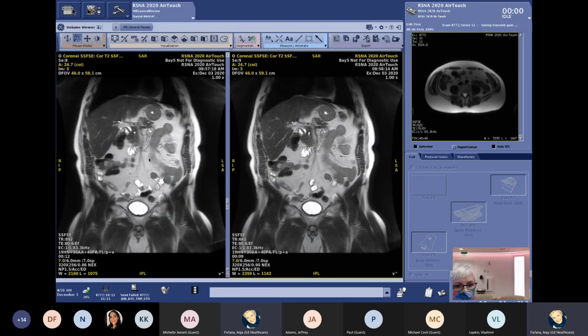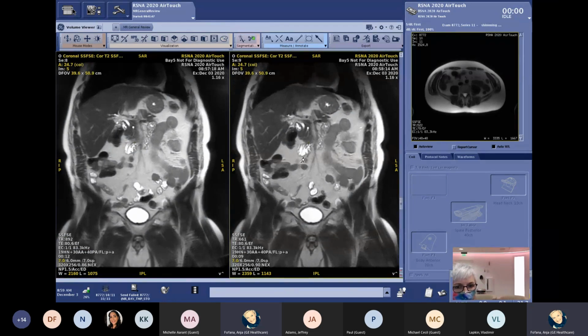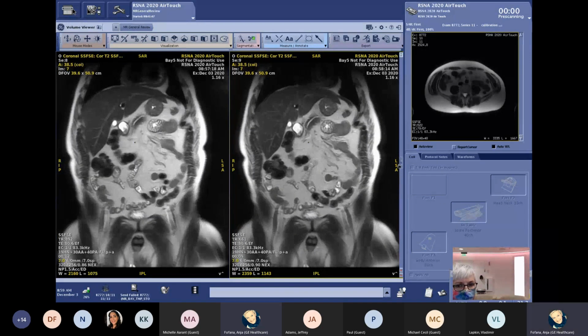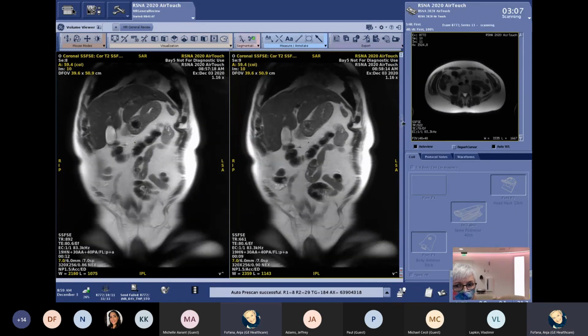And then again, here is the single shot sequence. Left-hand side was done with an acceleration technique of 2. That is why we had one breath hold of 12 seconds. Right-hand side is acceleration by 3, and we have only 9 seconds of breath hold. You see, when I scroll through the images, that you don't really lose any detail. You have the same image quality. You can just be faster.